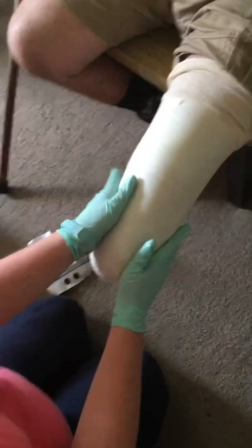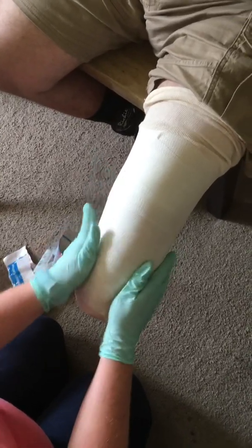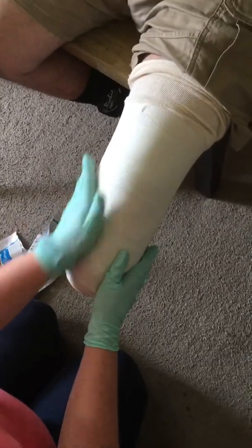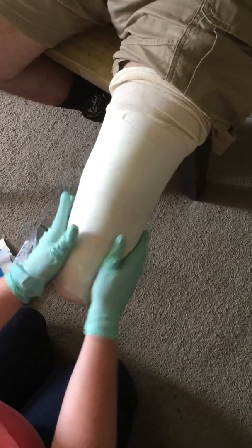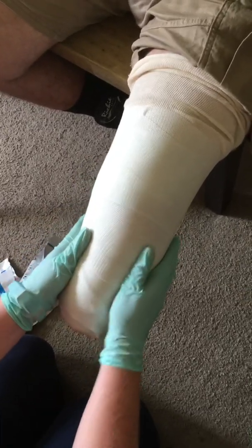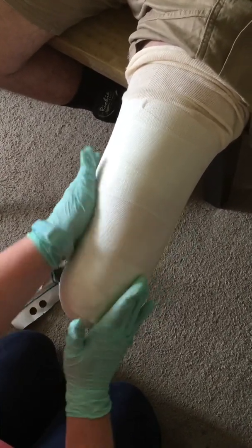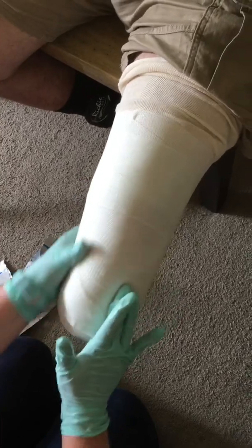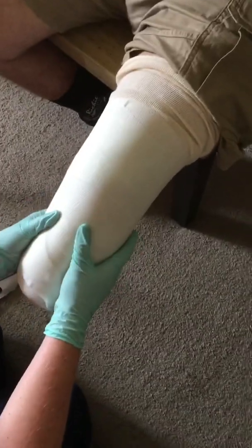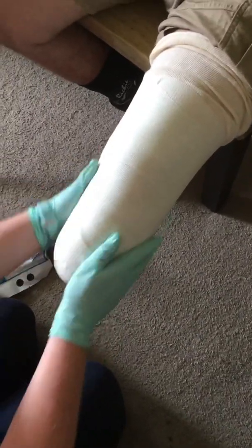Now it's time to pay attention to the anatomy we reviewed earlier. Using the heel of your hand you want to massage into the medial tibial flare and then use your thumb to start working the interosseous groove. These are the two main areas that you're going to be paying attention to and working as the casting material starts to set up. The main reason we focus on these two areas while casting is because this will give us good control over the location of the tibia in the socket and prevent the socket from rotating on our patient. Both of these areas are really great for weight bearing and help relieve any pressure the patient may be getting over their tibial crest or on the anterior distal tibia.